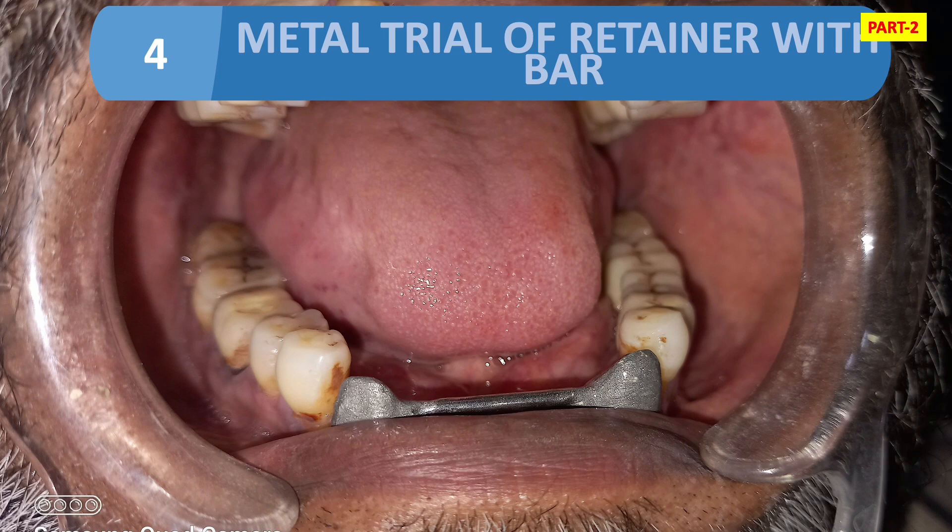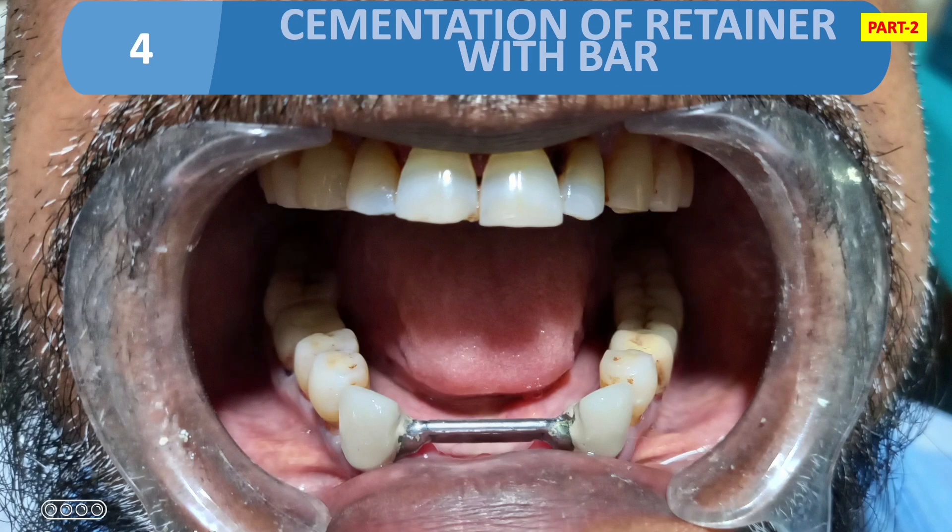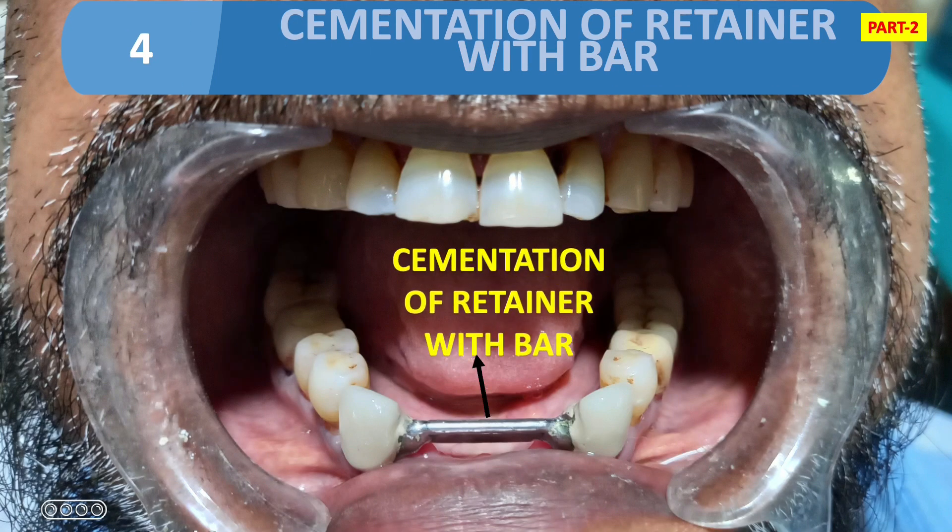The fourth step is metal trial of the retainer with bar. Look at the figure — we have a metal trial of the retainer connected with the help of the bar. After trial of the metal with bar, we will do ceramic layering of the retainer.